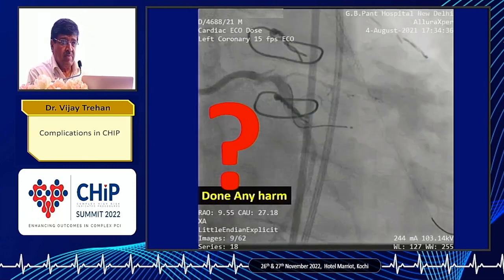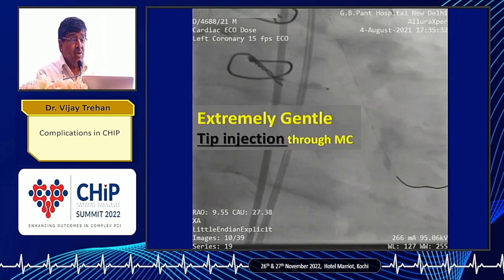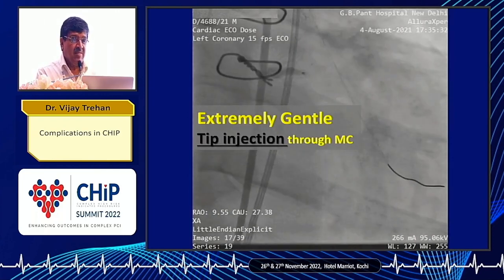Anybody? So if nobody says no harm, I'll also assume there is no harm. At least the injection didn't show. Then I thought, let me inject through the tip of the microcatheter. Have I done any harm? Anybody?